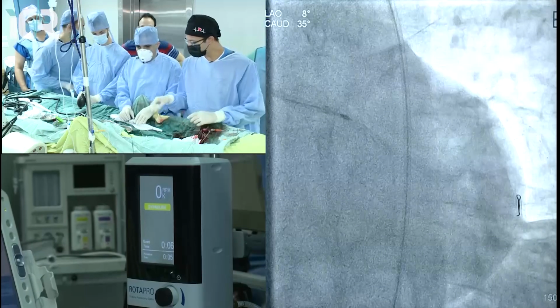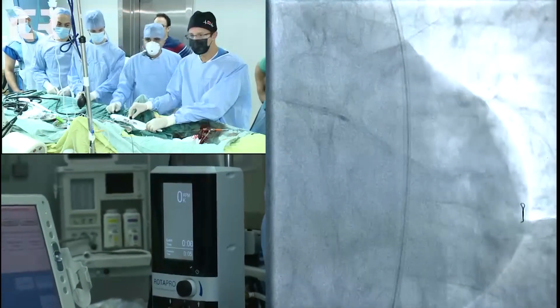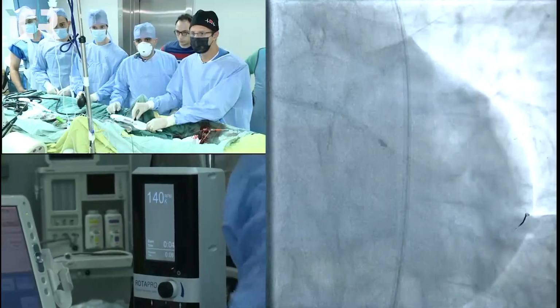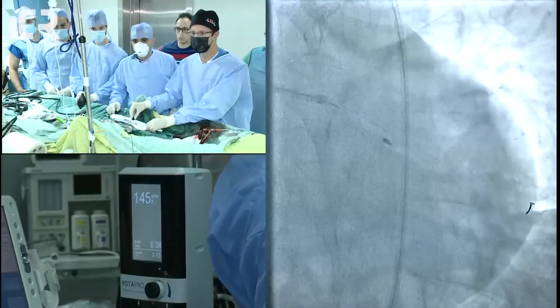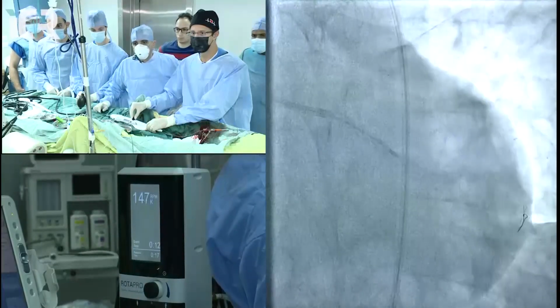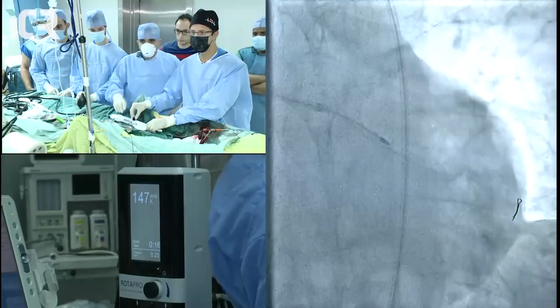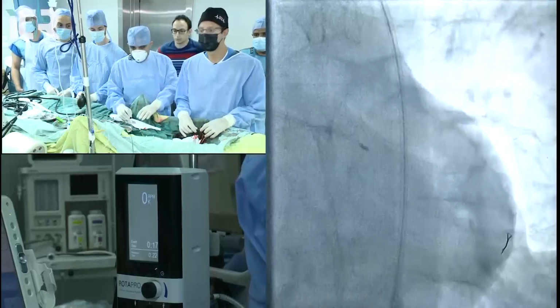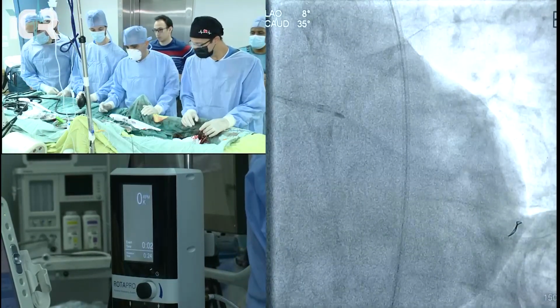So we start by pressing the button of the rota. This is the rota, and we check and go outside. I think it passes freely now, so we can stop now. So this was the first run. I think it passed smoothly at the end.